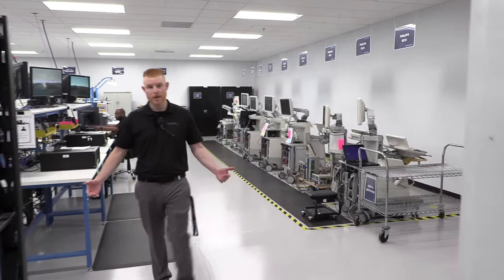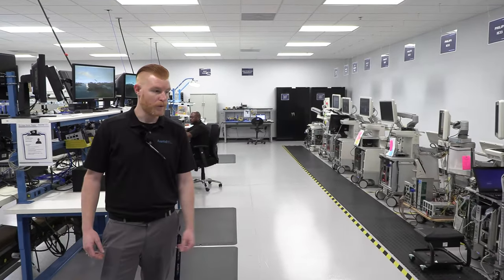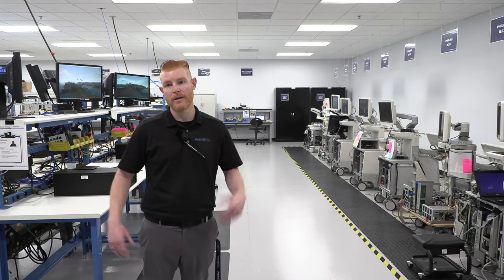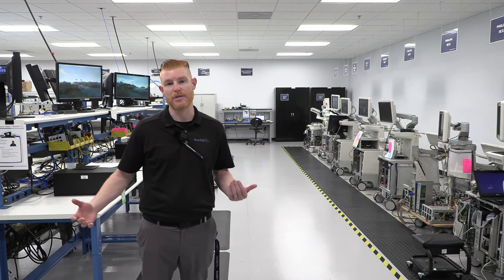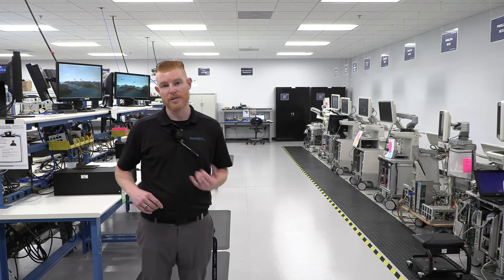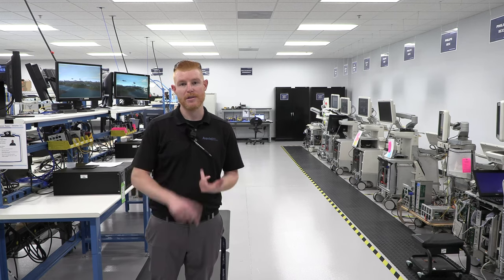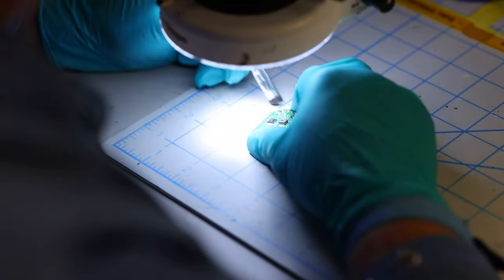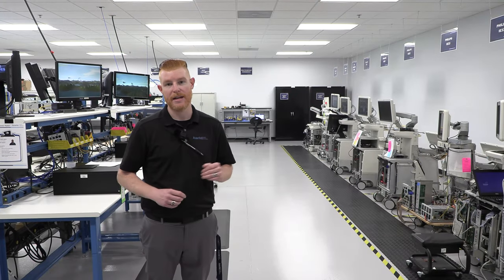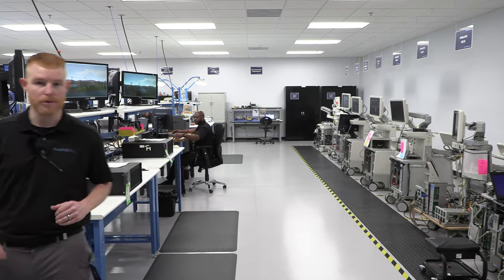All right, so you're coming into our repair lab here at our Charlotte Center of Excellence. What you'll see in here is a multitude of things. We do multi-modality repair, so we support all branches that we do in this facility. As you've seen so far in this video, we support our diagnostic imaging, ultrasound, and oncology. So in this lab, we're doing PC repair, component level repair, and assembly level repair for things like chillers, pumps, compressors, and also MRI coil repair. We'll step you through and show you some of what we're doing here.